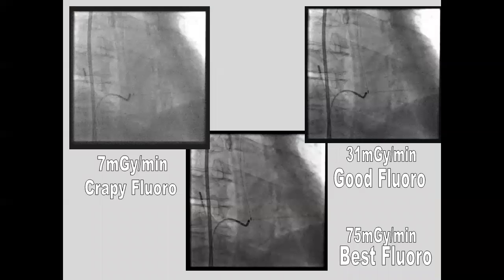Now this is the difference between our crappy fluoro, our good fluoro, and our best fluoro. So this is what we see when this is an actual EP case, of course. There's an EP catheter right there out the coronary sinus. So this is the image that we usually use most of the procedure. Now, when we're doing something like a transseptal, doing an epicardial access, something where we need to see better, then we'll step up to this next one. You can see what the jump is in our radiation, from 7 milligray per minute up to 31.